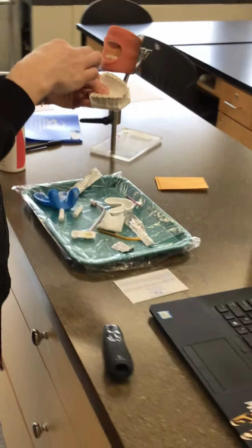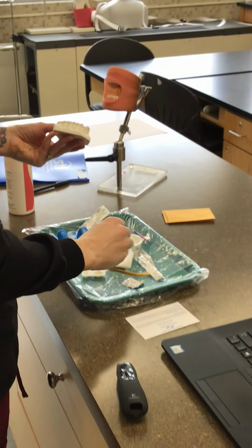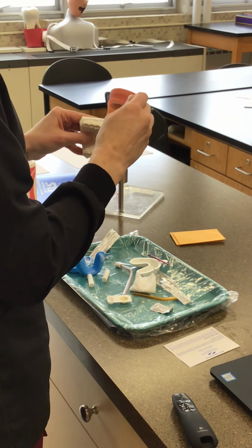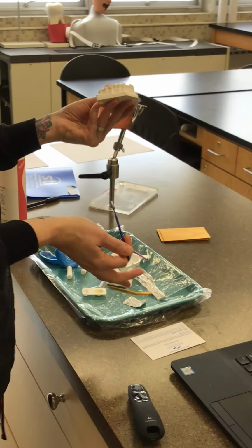That's ideally how you would do it, and it's gonna flow down, okay? It's not necessarily going to on the stone model. So you're gonna do it, and then you can go back in and just make sure that you've covered all of the surfaces. You can get right into proximally. You can't do it wrong, okay? It just needs to cover all of the hard tissue surfaces, okay?